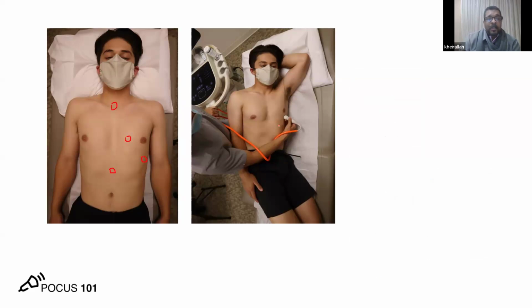So positioning the patient is so important because it has an impact on the image quality. The right way of positioning the patient is important for the image quality on one side and is important for you as an operator on the other side, because you need to be comfortable. Being comfortable depends on positioning the patient, you know. If the patient is in a position like this, you are here and you want to come all the way here, it's going to be difficult. It's not like this one. So make sure that you are comfortable and the patient is comfortable and the image quality is at its best in terms of positioning the patient.